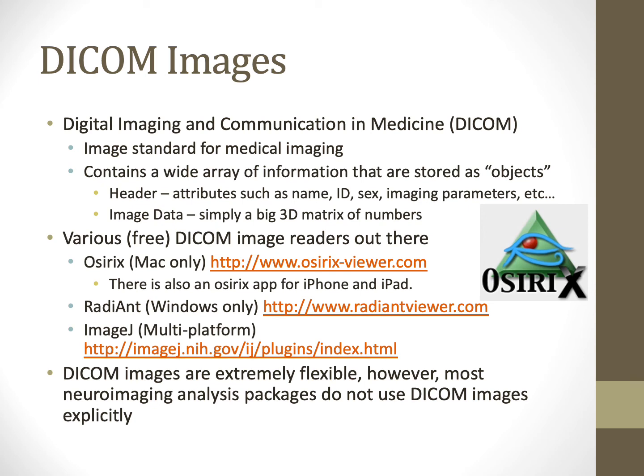In this lab, we will introduce you to two different image types. The first, Digital Imaging and Communication in Medicine, or DICOM, is an international standard for medical imaging. It contains a wide array of information that is stored as objects.